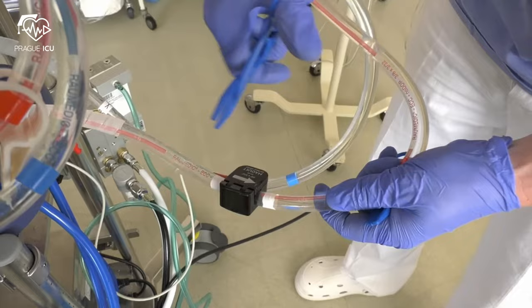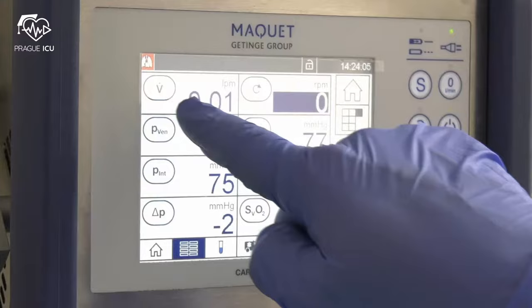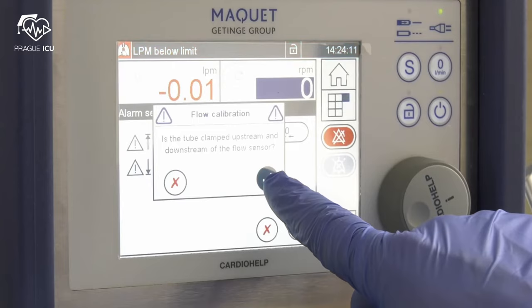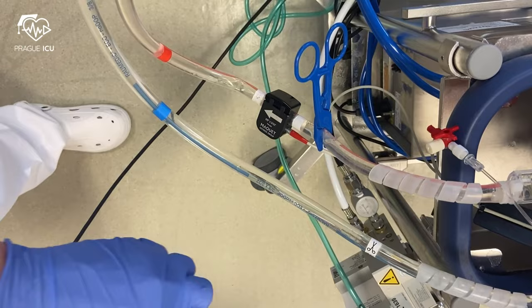Clamp the red lines before and behind the flow bubble sensor and calibrate the bubble sensor by setting it to 0 liters per minute. Remove the clamp behind the bubble sensor and clamp the blue line.